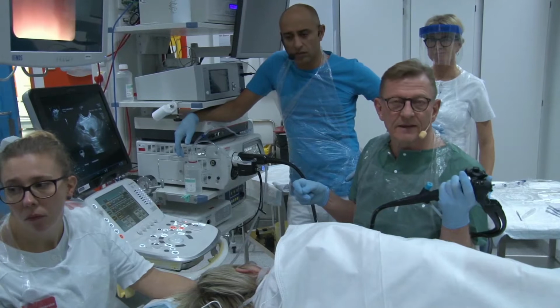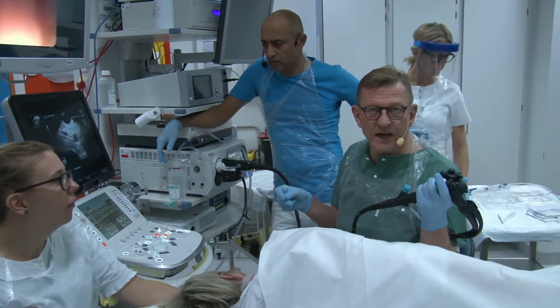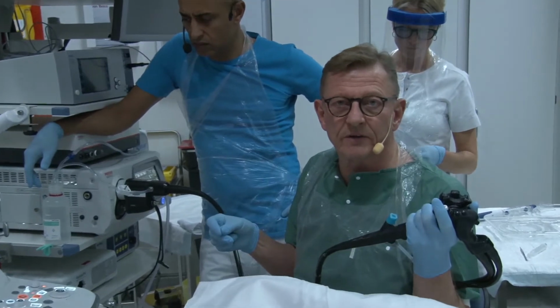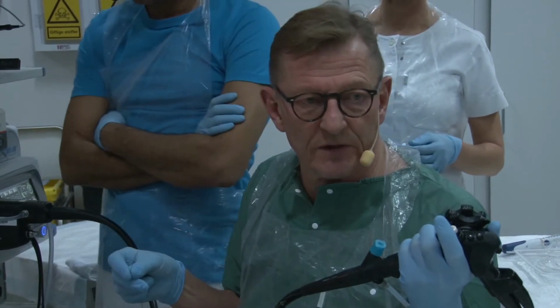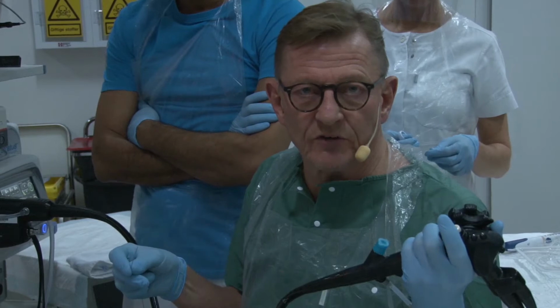Welcome back. I hope you enjoyed lunch. We have, in the meantime, prepared the first patient for you, and you heard the medical history of the patient. The aim is, as you heard, to do an EUS-guided microbiopsy from the cyst or one of the cyst walls.